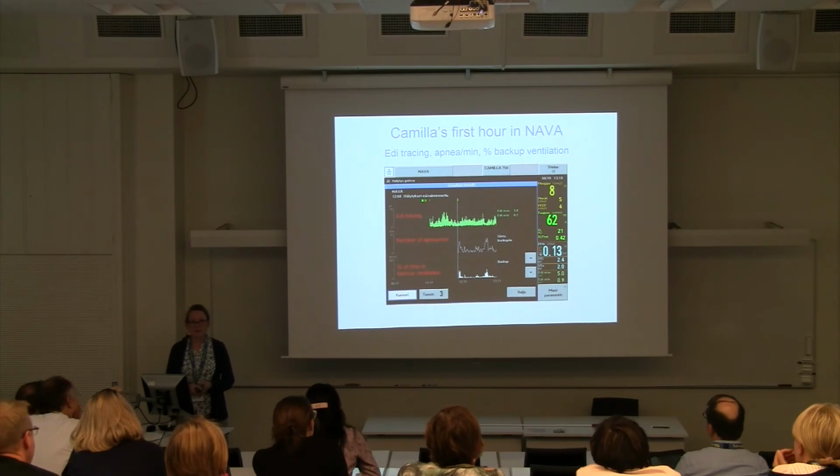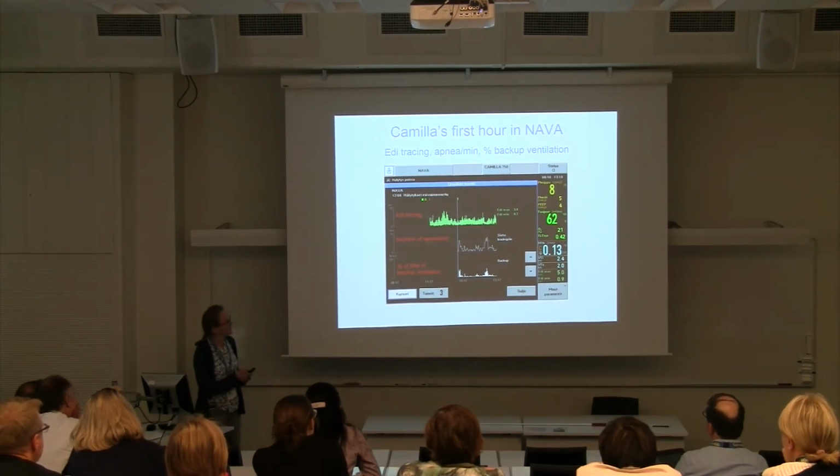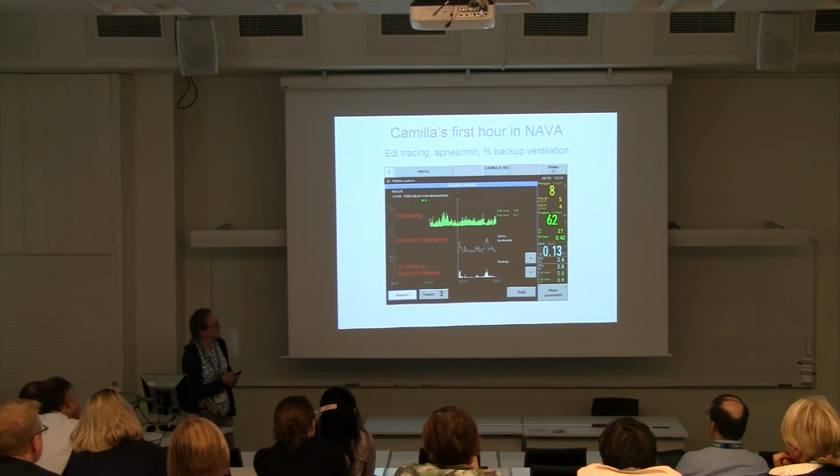And then some more of these trend curves. Here is the EDI tracing, and the EDI peak value becomes a little bit more stable after the switch to NAVA. Here is the number of switches to backup ventilation. It's from 0 to 15.